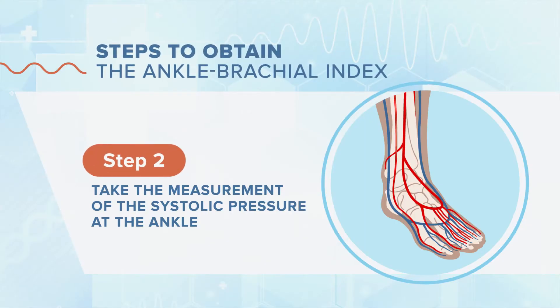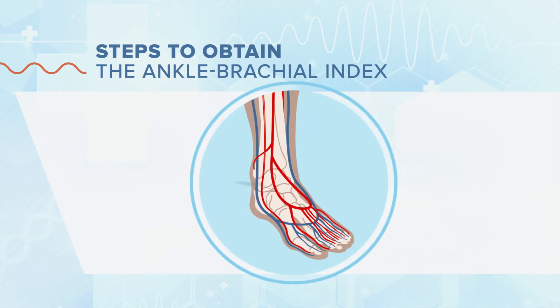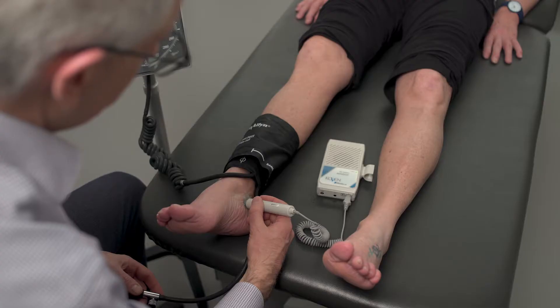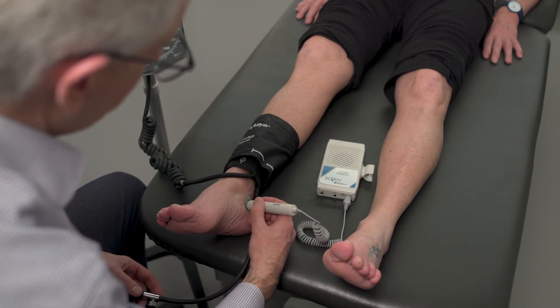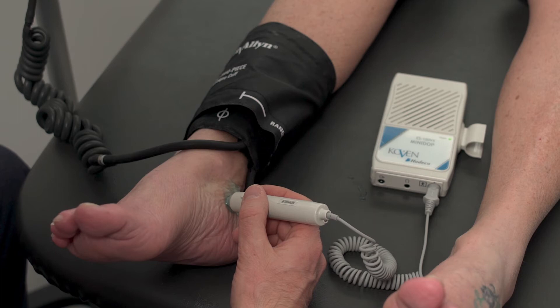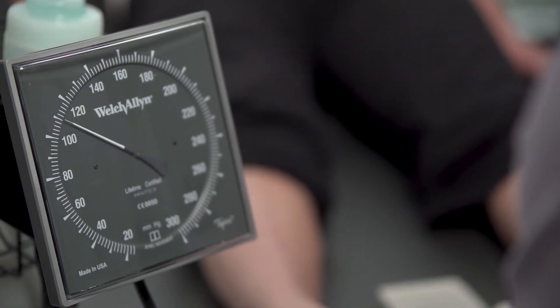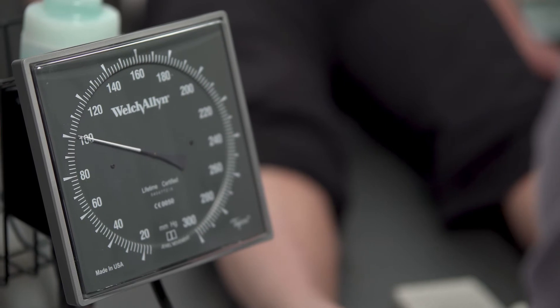The second step is the measurement of the systolic pressure at the ankle. There are two vessels in the foot. One is the dorsalis pedis artery, which is just lateral to the extensor of the first toe, and the posterior tibial artery is right behind the medial malleolus. The blood pressure cuff has to be placed right above the malleolus. We have to put the gel right behind the medial malleolus and over the dorsum of the foot. Now we can hear the triphasic signal on both arteries. We have to blow the cuff up and release it slowly, first on the posterior tibial artery and then the pedial artery.